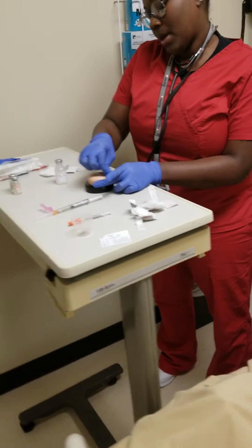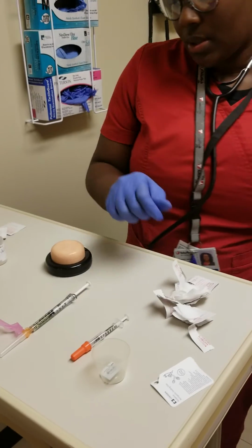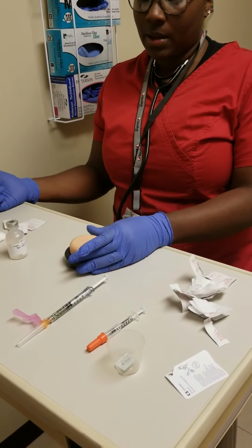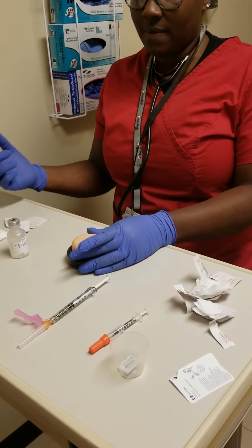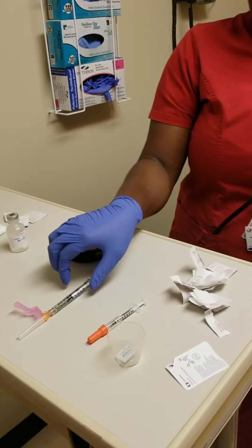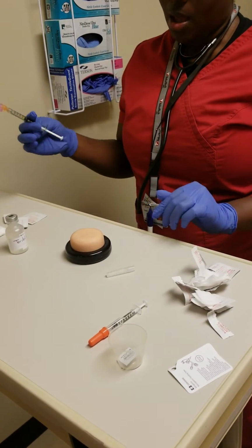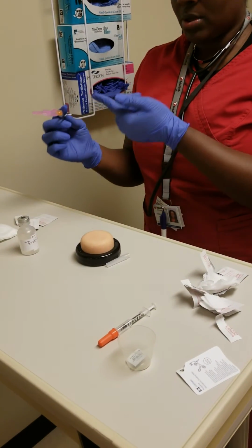And this medicine is going inside the muscle, so you don't have to squeeze, because with the sub-Q, I want it to go into the fat. That's why I squeezed it, so that it can go into the fat. So I will uncap it. My patient is a smaller patient, so that's why I'm using a smaller needle.